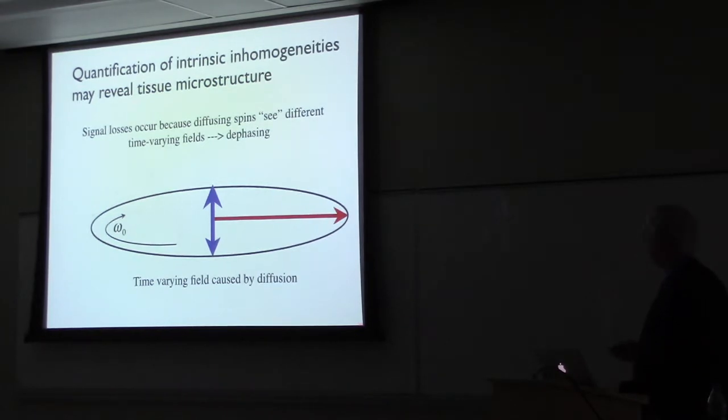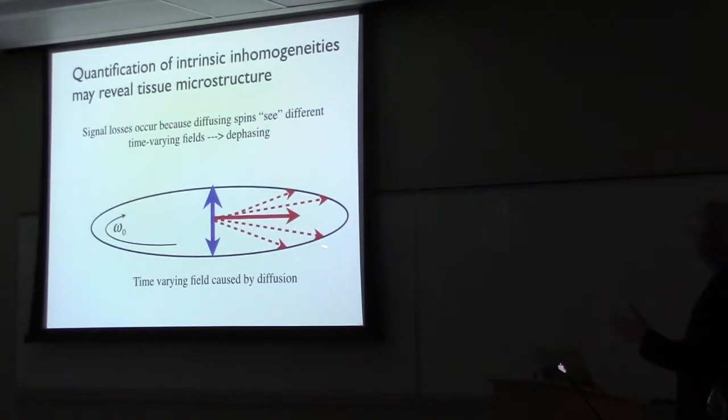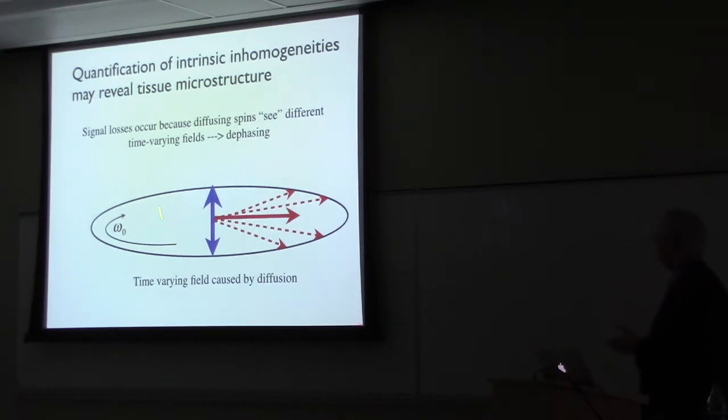And what it means is if you have a varying field, just like the field determines the frequency, this macroscopic magnetization, remember, comes from all these different contributions, different spins. They will each gradually fan out in this transverse plane, as they go at slightly different frequencies, different phases, and it's because of that that you get the signal loss. These all add up to a reduced net signal. So it's because of this problem.